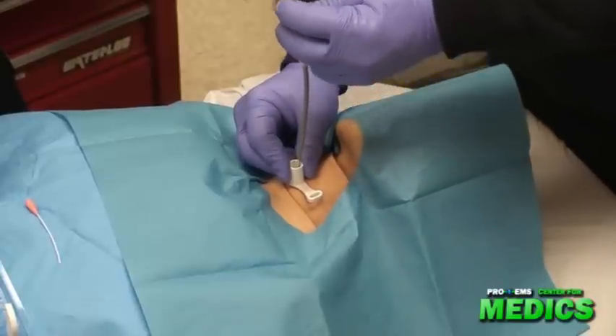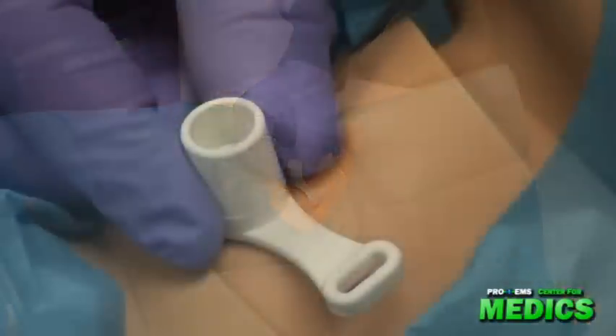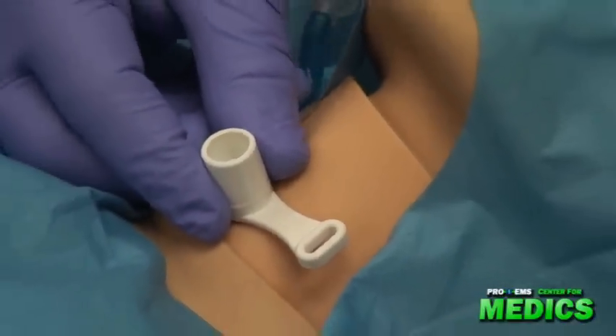Securing the airway, I remove the guide wire and the dilator. I now inflate the cuff with eight to ten cc's of air.